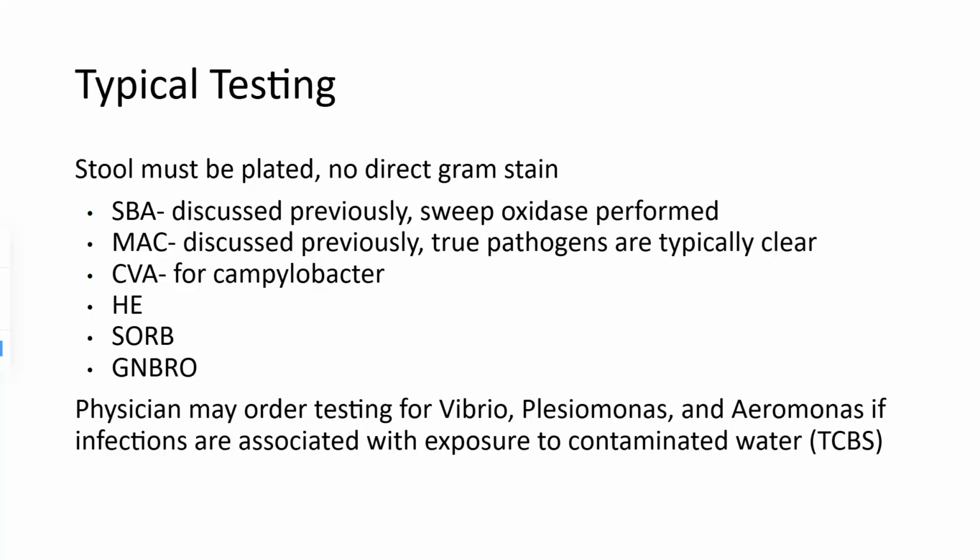to contaminated water. So if the patient has a history of traveling to areas where these things are endemic, if it's suspected that there's flooding or a contamination of a whole bunch of water somewhere, these organisms are water-loving organisms and found and transmitted through the water. So that would give us clues that we would probably want to use some type of specialized media. TCBS is a medium that's selective for Vibrio. So that's one of the agars that we would use to identify Vibrio in the lab. So if we suspect this type of organism, we would plate it on TCBS as well.